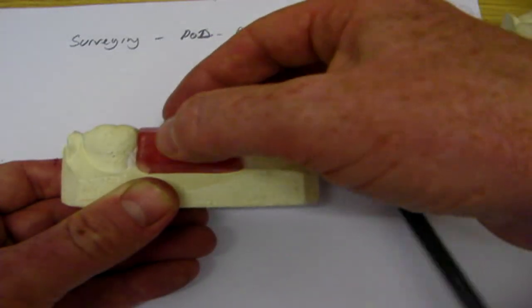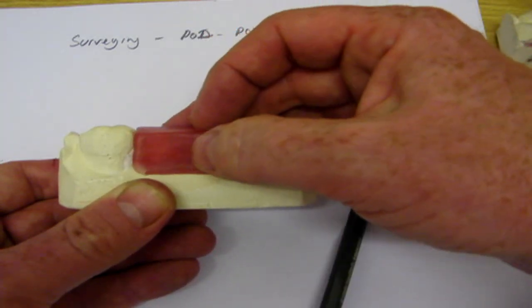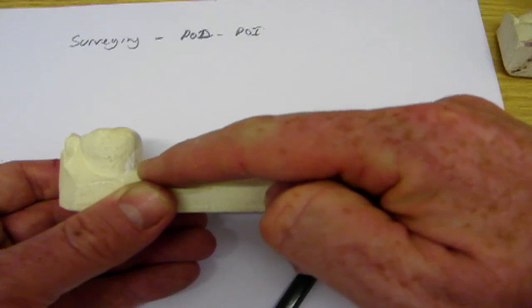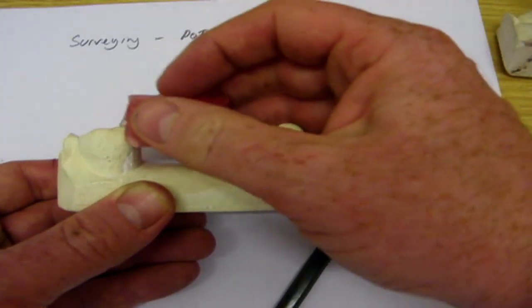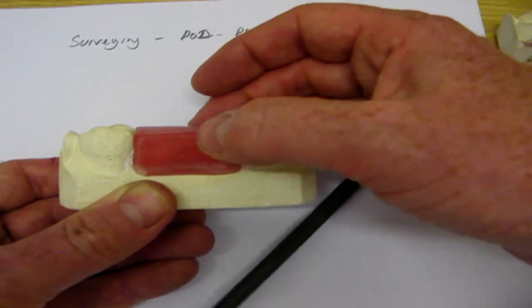Okay, so that's all the undercut's been blocked out on the model. The denture gets produced, and then when this gets fitted in the patient's mouth, obviously there'll be small gaps in between the denture and the tooth where the undercut exists.